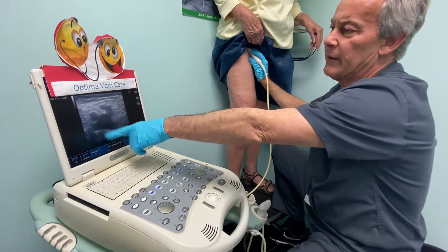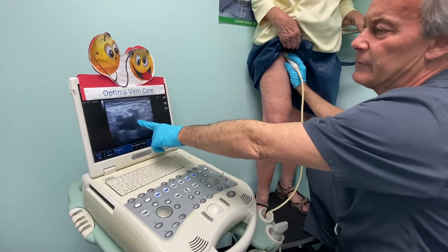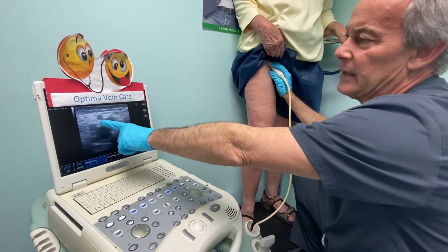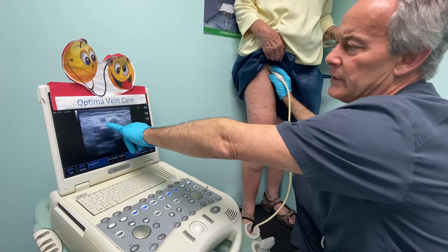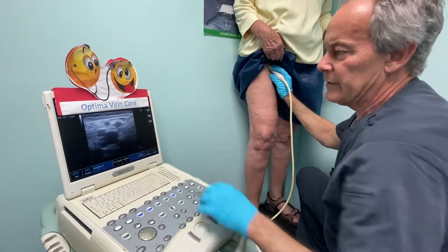First we're looking at the common femoral vein, the junction of the great saphenous vein and the common femoral vein. We're going to see where the glue actually started. As mentioned, it's a right AAGSV saphenofemoral junction. You can start to see the glue here — you can perceive it a little bit.